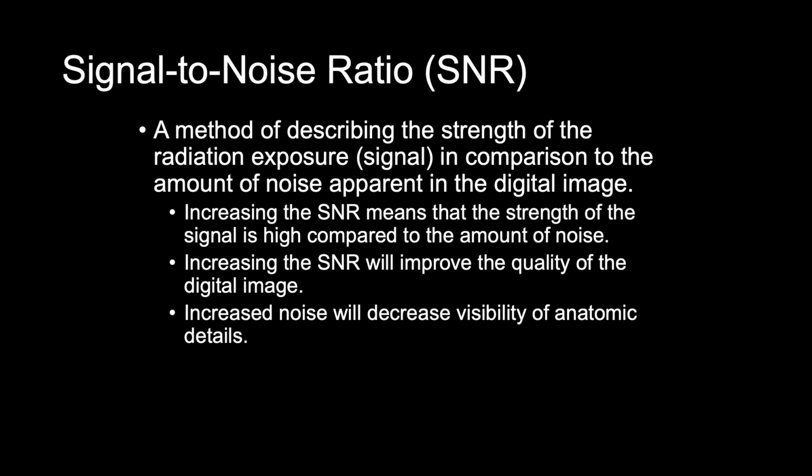So it's kind of like the risk versus the benefit thing, where we have to increase certain things to get a good image quality, and we just have to take the risk of giving the patient a little bit more X-ray exposure. So risk versus benefit. The benefit will be that we get a really good quality diagnostic image to send to the radiologist, and then the risk will be increased patient exposure.